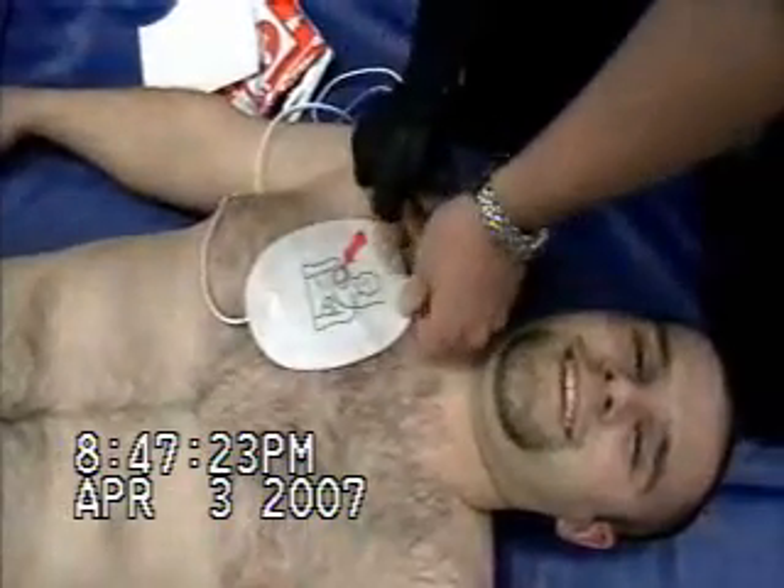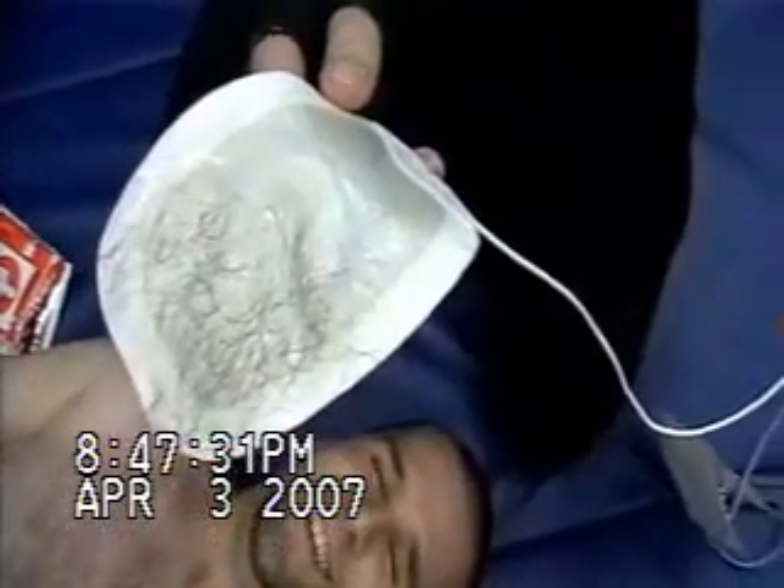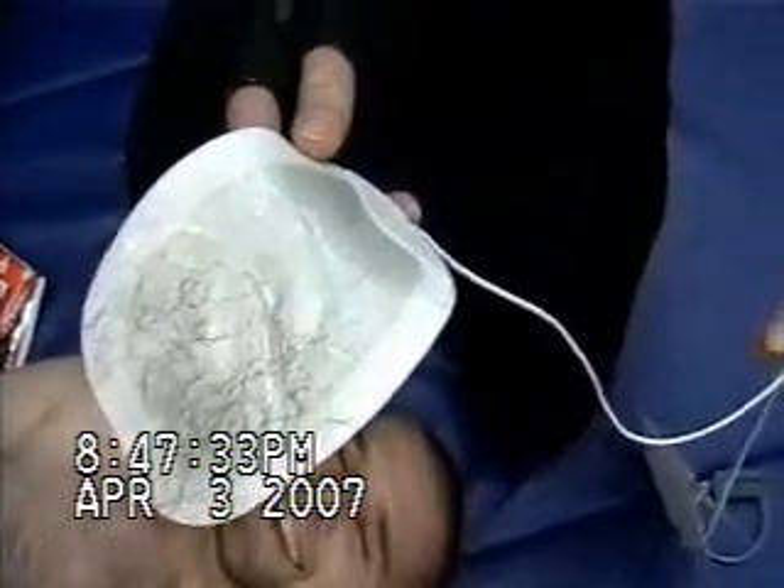Okay, alright. Come on! Fast — don't rip it. Okay, let's see the pad. That is definitely some hair. Definitely some hair. But I'd say there's still a lot of hair there, and there's too much hair to keep the pads sticking.